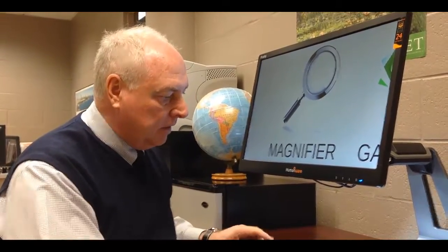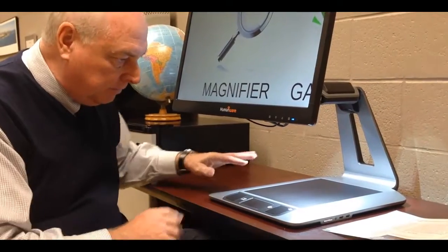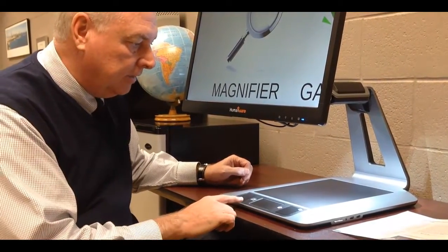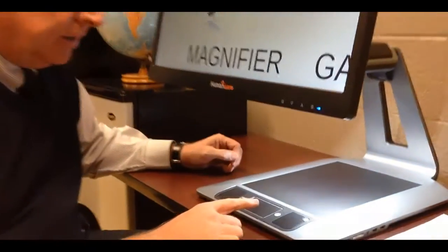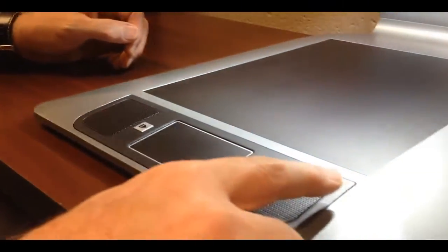This particular model has a 24-inch screen. It also comes in a 20-inch screen. And as you can notice down below, there's no XY table for this reading device. It has a platform where you place your material, and it has two buttons: basically a read button and a back button. There's also a power button over to the right here.